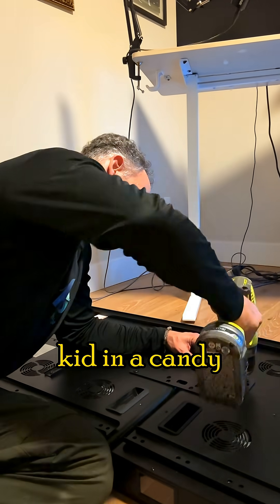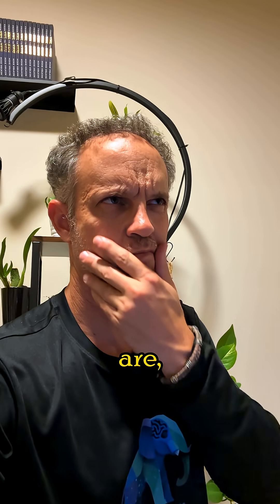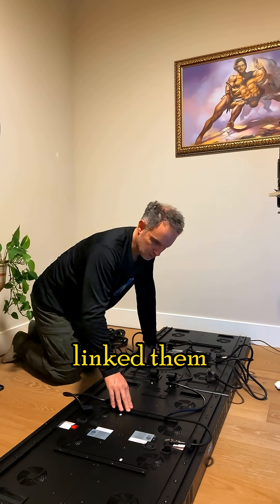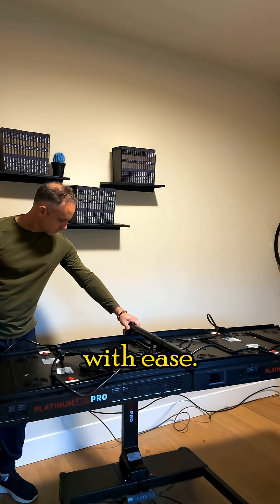I was like a kid in a candy store. After mounting the first one and seeing how sweet they are, I got an idea — I ordered two more panels. Now I have a four-panel setup, and I linked them all together. Even with four panels, the stand rose with ease.